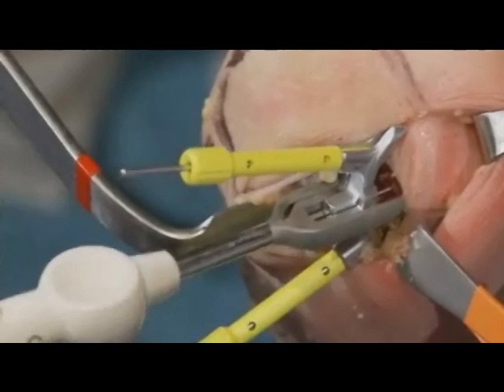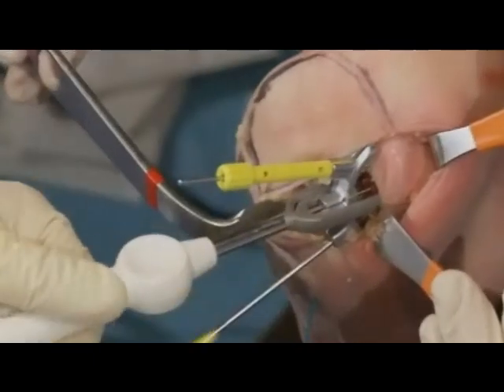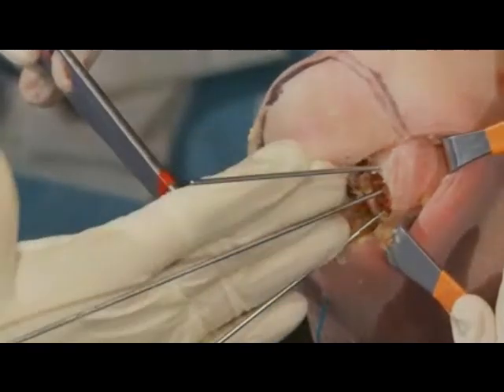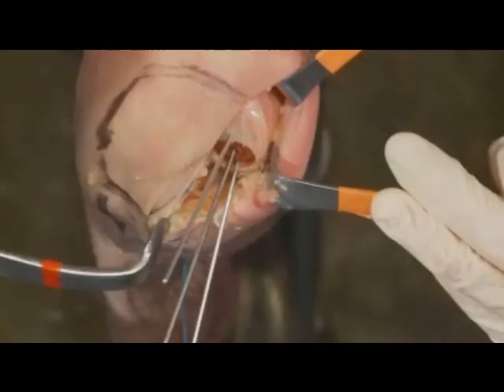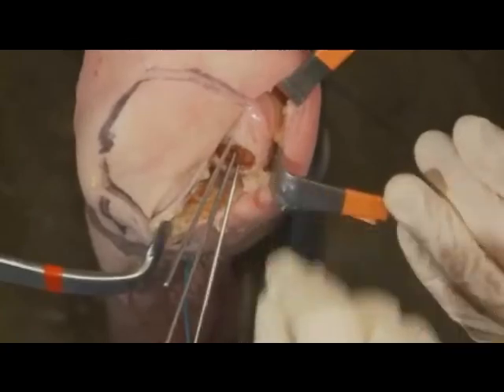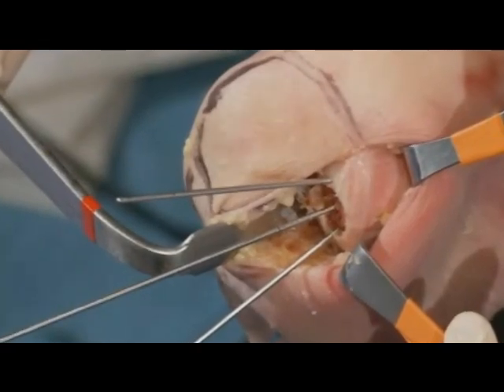All right, and so that's the position. Now, once you're in position there, you remove the 2 yellow pins from the bottom, from the top. You remove the central device, and if you've done everything properly, you can see that these are all parallel. So if you're parallel, you know that you've got the pins in the appropriate position. The second check is that you look and you see the bottom pin and the top pin are right at the levels of the hole, so that we know it's pretty symmetrical around there, so that our reamings are going to be good.